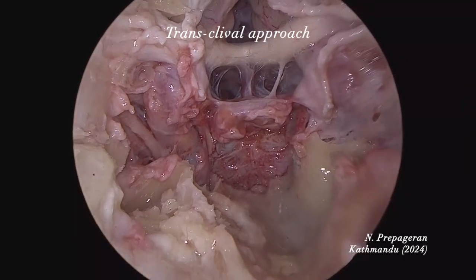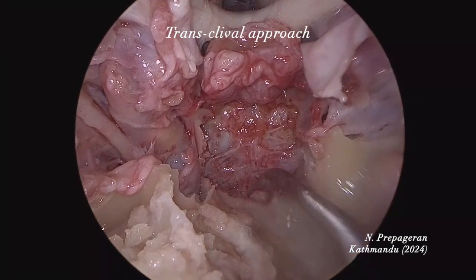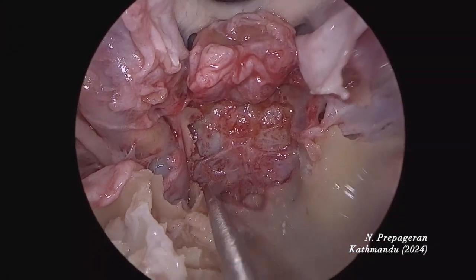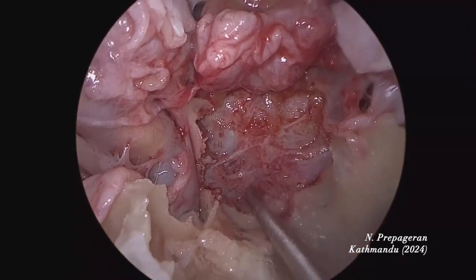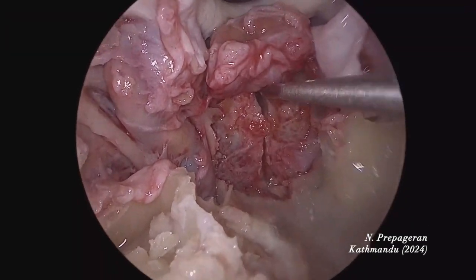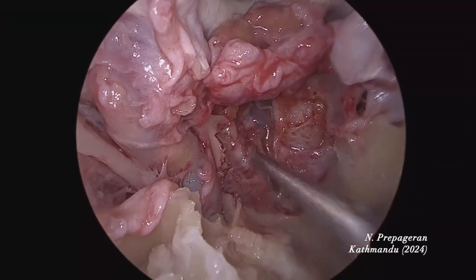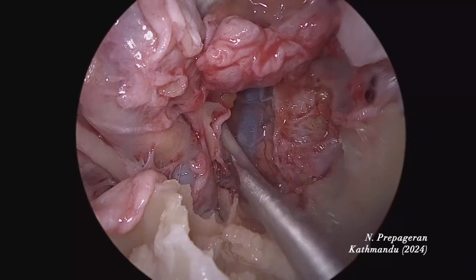Now I'm going to open the clivus. Let's open the clivus. When you open the clivus, if everything goes well, you will see Mr. B. In India, Mr. B is Amitabh Bachchan; in skull base, Mr. B is the basilar artery. Can you see? The basilar artery.